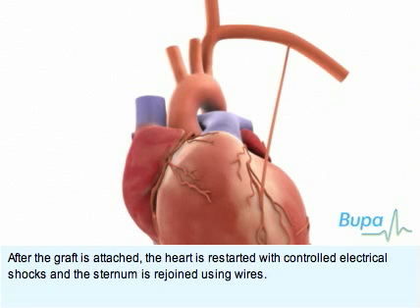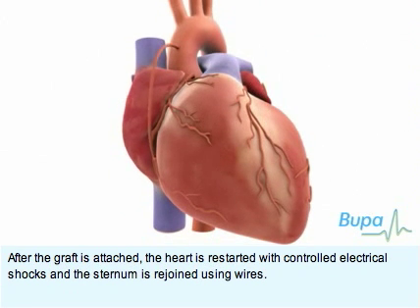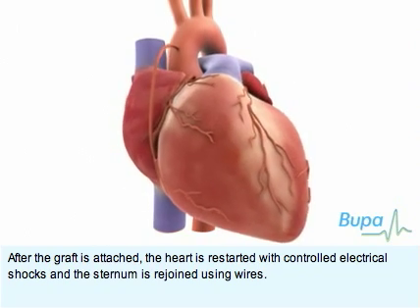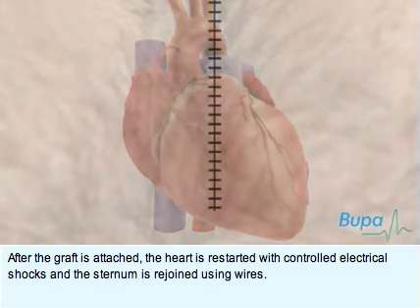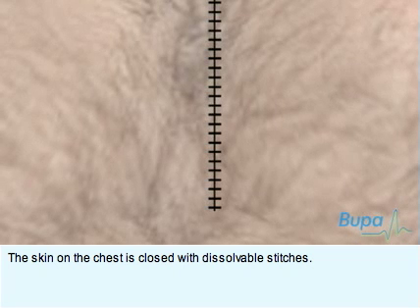After the graft is attached, the heart is restarted with controlled electrical shocks and the sternum is rejoined using wires. The skin on the chest is closed with dissolvable stitches.